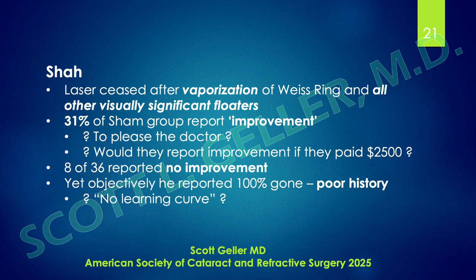And he justified this with direct visual inspection, fundus photos, B-scan ultrasounds, etc. I attribute this to poor history taking, and I'll go into that later. And Dr. Shah also said there's no learning curve with this. Well, that's interesting. How did he have 8 out of 36 with no improvement if there's no learning curve? Think about that.